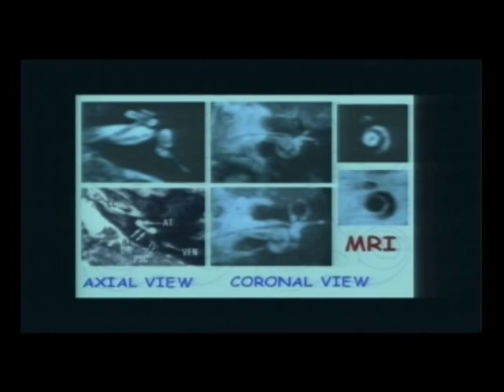The internal auditory canal, you can see into it. You can see the dark line of the cochlear nerve, and behind it, the inferior vestibular nerve. And very good eyesight can see this other dark line, which is the singular nerve. In this coronal cut, you can see the facial nerve above and the cochlear nerve, this dark, large nerve inferior to it.